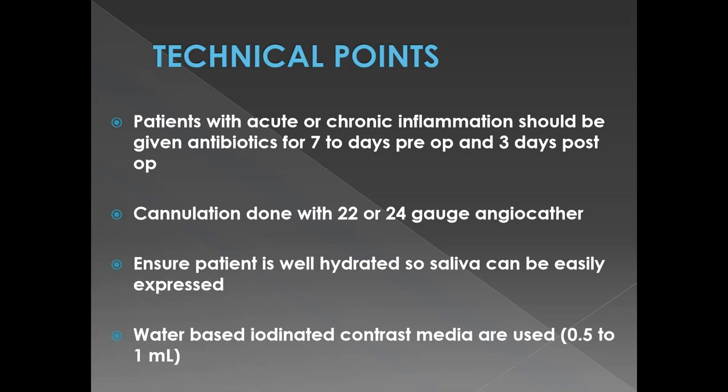You can do it via an IV cannula, but according to some videos that I was looking up in preparation for this webinar, they suggested using a specific sialography cannula. They called it a Ferruccia cannula, but I tried looking it up exactly, and I couldn't find anything by this spelling. Maybe I'll have to recheck the video about what exactly they called it.